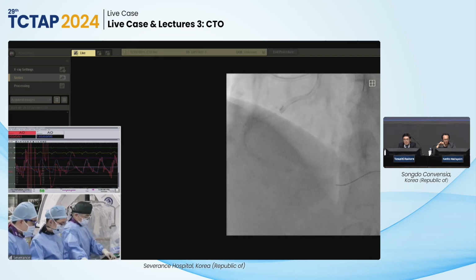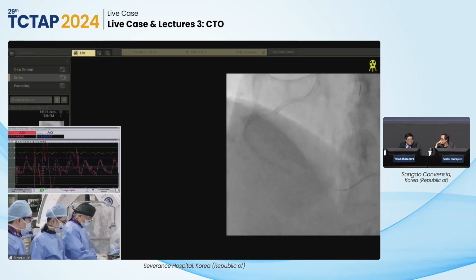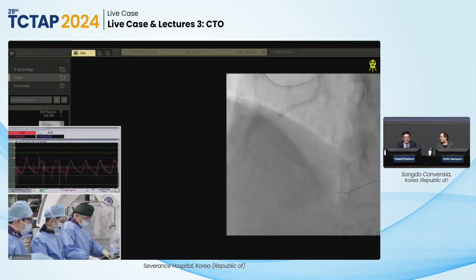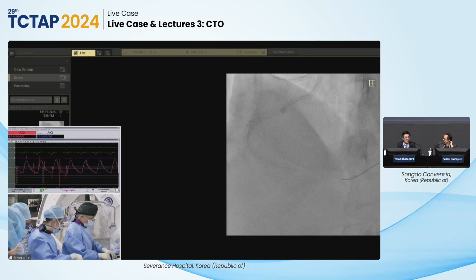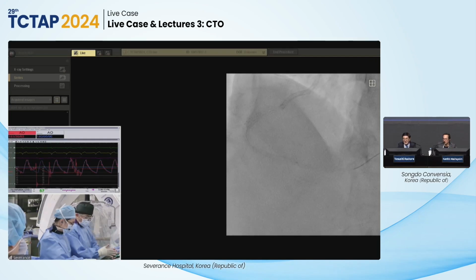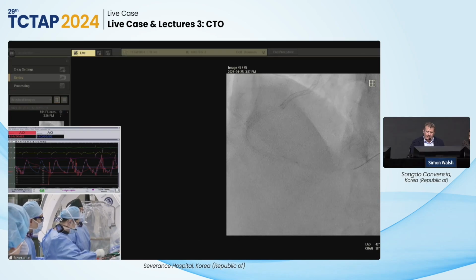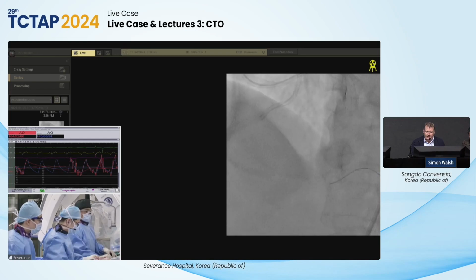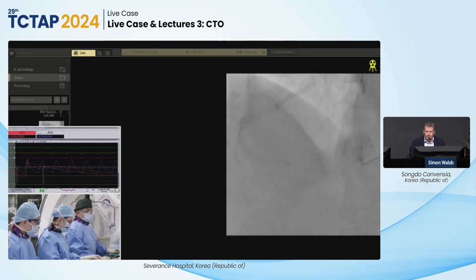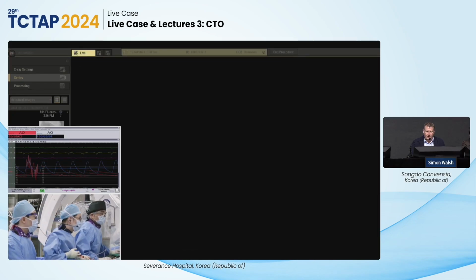Any further comments, Dr. Asakura, regarding the distal part? Would you put another stent or not? It's a very difficult question, but I think this result is acceptable. Just interested, I think in a couple of the images there, the guide on the left wasn't quite engaged, the microcatheters there. I think there's a little bit of plaque at the ostium of the main stem, so it's worth paying attention to that before bringing everything out of the left side as well.